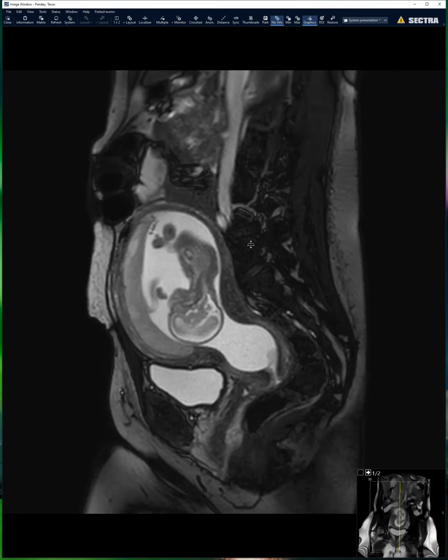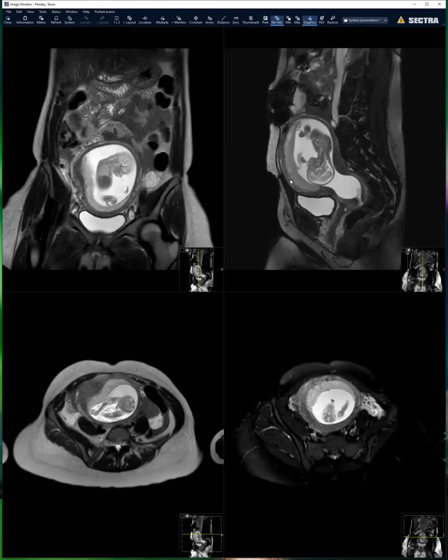And we did miss it. It was a call case where the resident was only focused on the appendix and they just said no appendicitis, but they didn't call it. But later on, when I looked at it, we thought that there is a case for abortion in progress, but unfortunately that was too late.